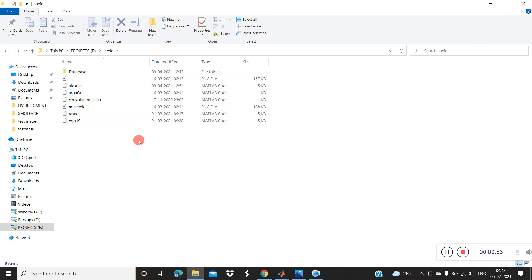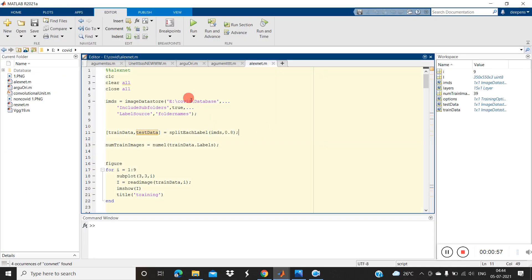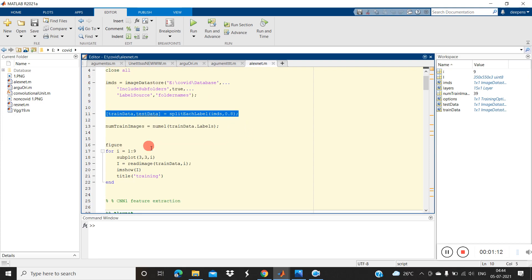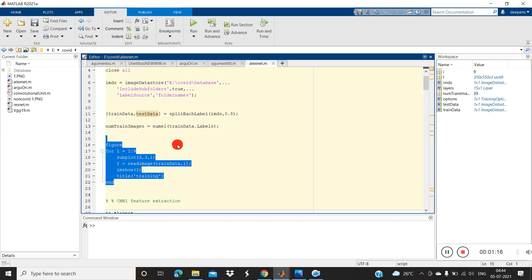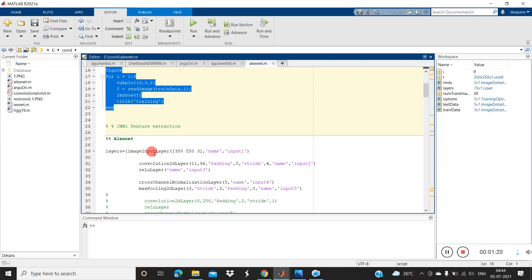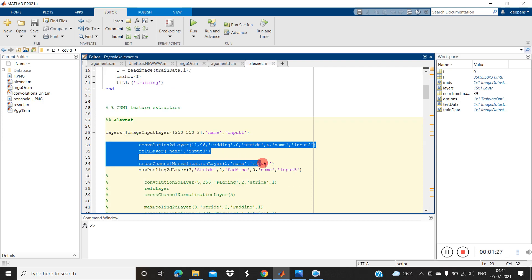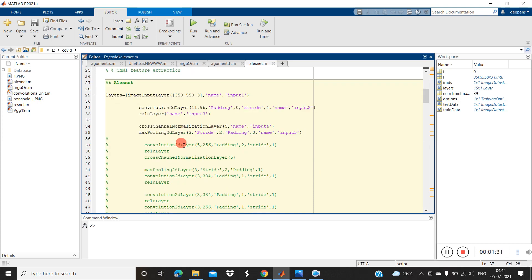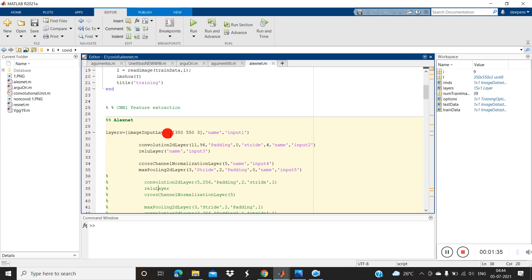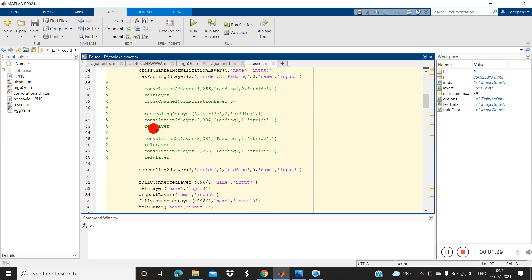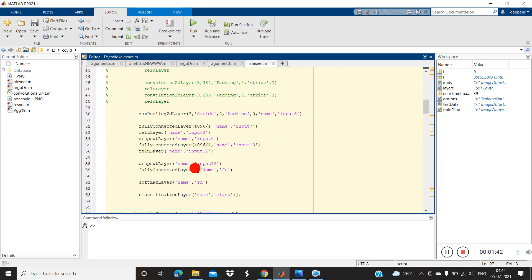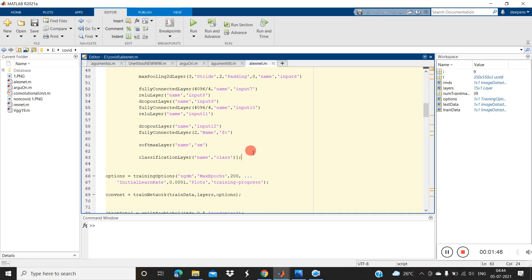Now I'll write the program for classifying the COVID samples using CNN. Open MATLAB, put in the initial commands, then give the path of the database. Split the training and testing data, then show the training images. Construct the layers: image input layer with size 350x550, then convolution, cross normalization, max pooling, and again convolution. These are the network layers based on AlexNet. Finally, set the fully connected layer to two, because we have only two classes in the classification layer.